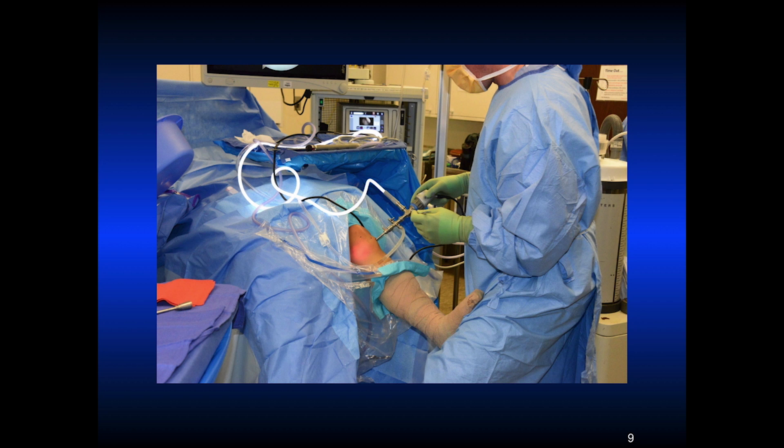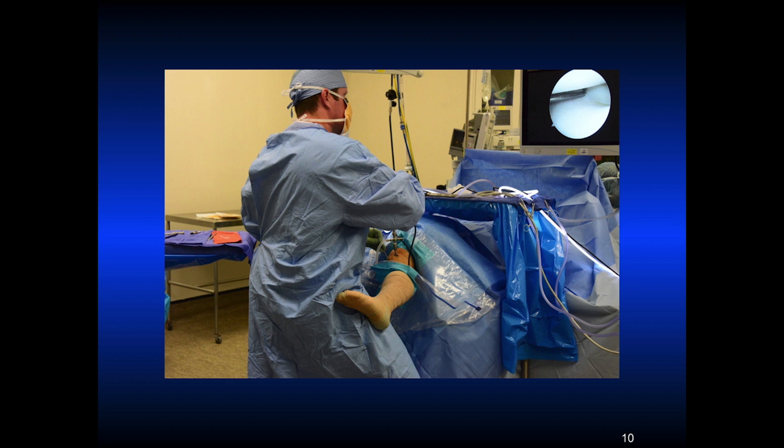Now the scope is in. I use horizontal incisions — go ahead and make an incision through the capsule. Do a routine arthroscopy putting the big 5-5 cannula up underneath the patella, sweeping down. You have to be able to manage the scope with one hand, manipulating the light cord with your fingers and holding the scope as ergonomically as possible. The medial portal is made under direct visualization with an 18-gauge needle and then an 11 blade. You can see the mayo stand at the center part of the table and also our screen is at the center part of the table over the patient.